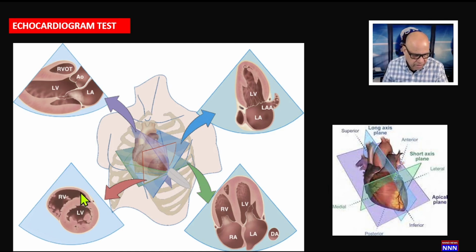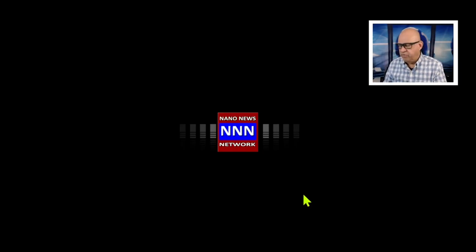So keep in mind, here we have the anterior wall, we have the anteroseptal, here we have the inferolateral, the opposing walls, then we have the septum and the lateral wall. So these are extremely important depending upon whether you're looking at the two-chamber view, three-chamber view, or long axis or short axis. So ladies and gentlemen, this is a very quick synopsis of various echocardiographic views and the anatomic structures related to them. And once you learn this, memorize this, make it internal to your system, it should come as second nature every time you place a transducer.